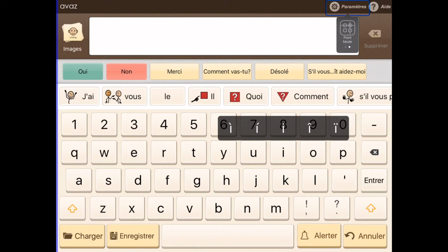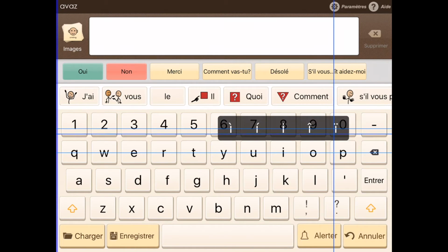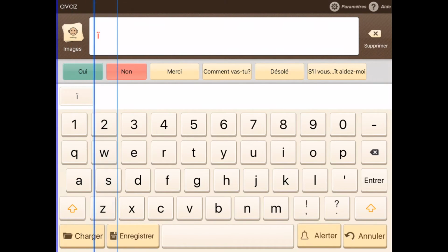And this is where things get kind of hard, unfortunately. Again, I'm trying to, okay, here we go. So as soon as this gets by the one that I want, I'm going to try to use the left switch. I want to wait for it to come back here, and then hit the left switch again. And we are going to go ahead and tap on it. There we go. So we've got this nice beautiful letter up there.